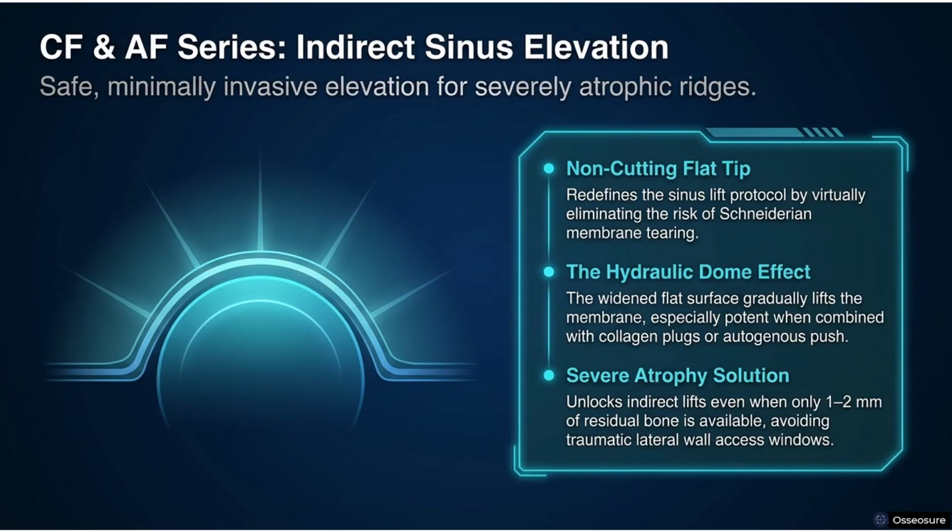I will show you the case where I have achieved an indirect sinus lift in 0.75 millimeter of available bone. I don't expect everyone to start at 0.75 or 1 millimeter immediately. But all my students are successfully performing indirect sinus lifts in under 2 millimeters of available bone. So why not you?